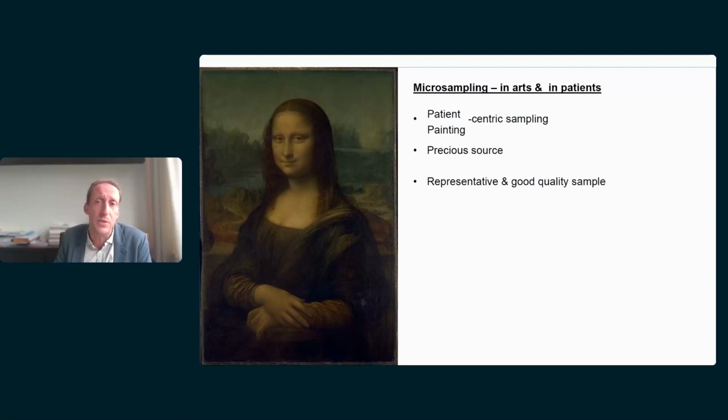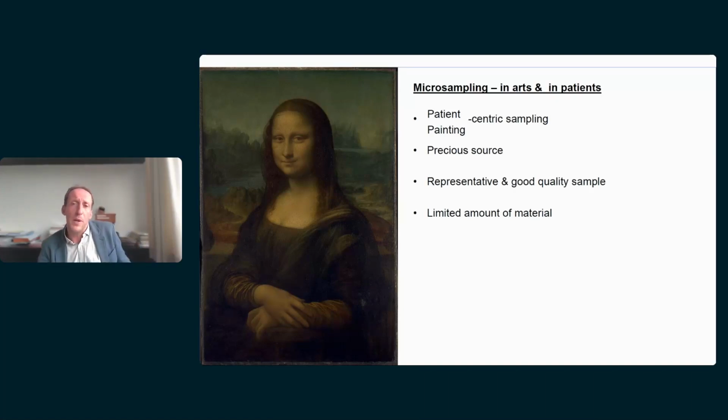Likewise, we can only expect a good result from a good quality sample, also if we consider microsampling. In a sense, that's where everything starts. And when considering a representative sample, that's actually what we really want. We want a blood sample or a serum or plasma sample derived thereof. Because we know what a serum or a plasma concentration means, we can also use a blood sample. And it shouldn't matter whether that's a regular blood sample or a microsample from a blood context.